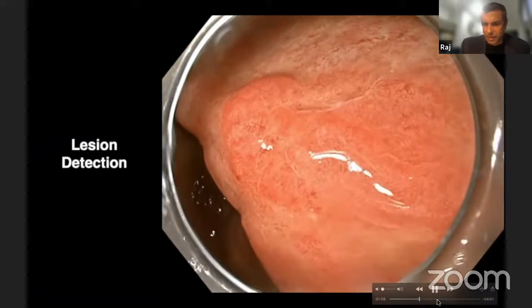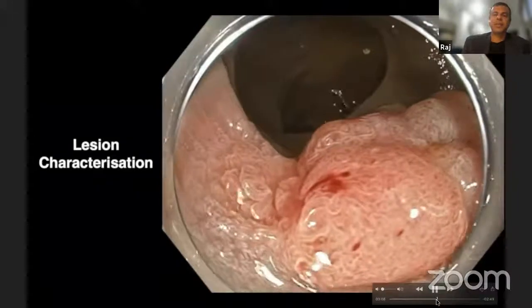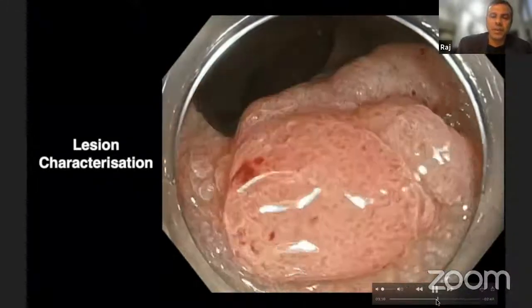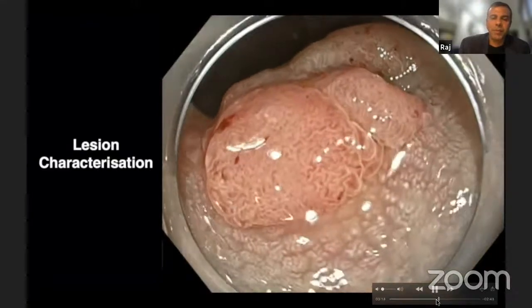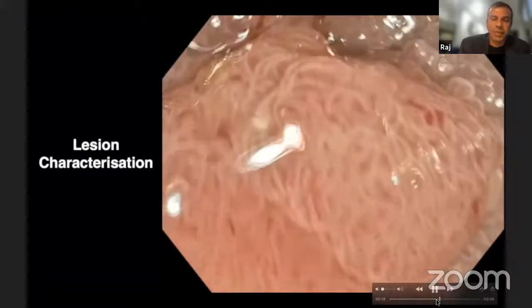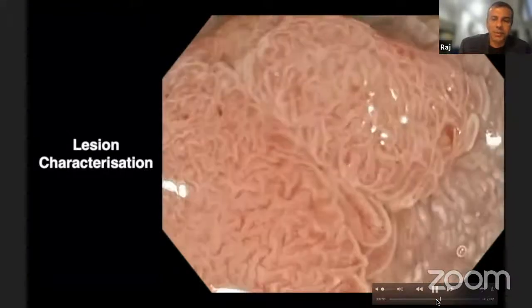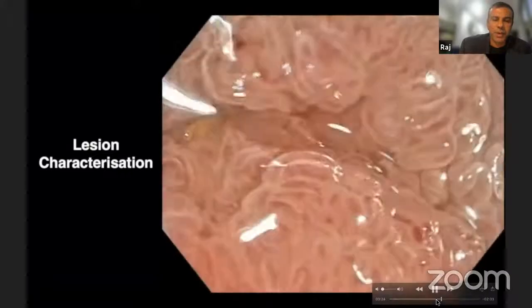That's TXI, as you can see there. And this is just on characterization. So the useful thing about this is that we may be able to start using the Kudo classification back into play, actually, because chromoendoscopy is probably not quite needed with TXI.